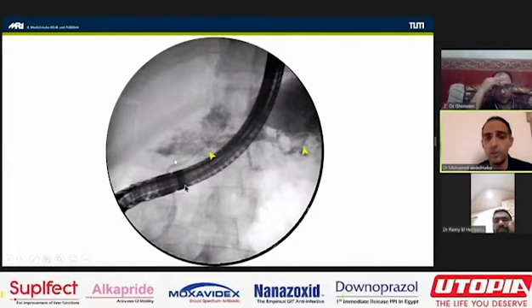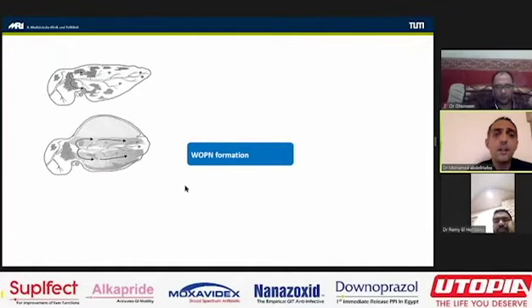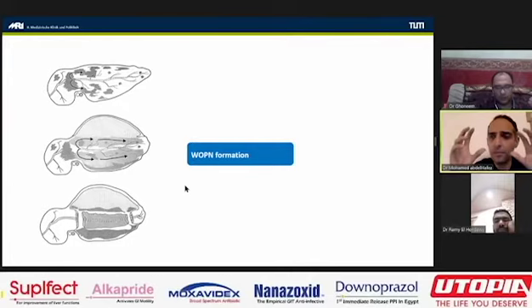Still not a pseudocyst, as we see, it is an inhomogeneous, irregular picture. With walled-off pancreatic necrosis, as we can see here, the enzymes are activated, tissue is digested and will become necrotic. I have to say something. Pancreatic necrosis is not actually pancreatic necrosis. The pancreas organ is not that big. We saw cases with 16 or 18 centimeters of necrotic tissue. Of course, this is not the pancreas. It is the fat tissue, which has been digested with active enzymes.